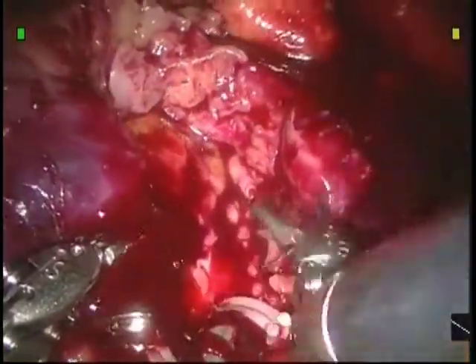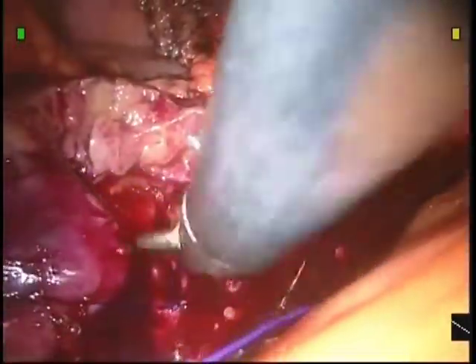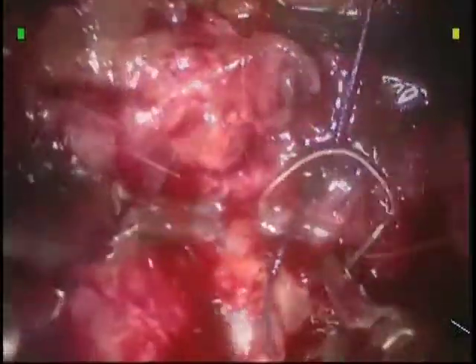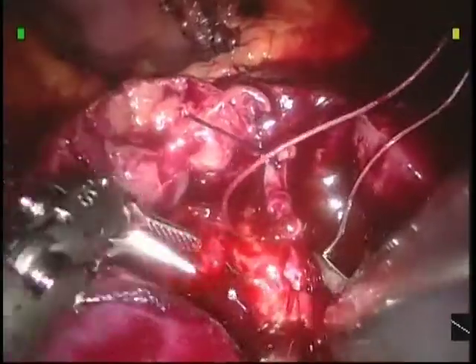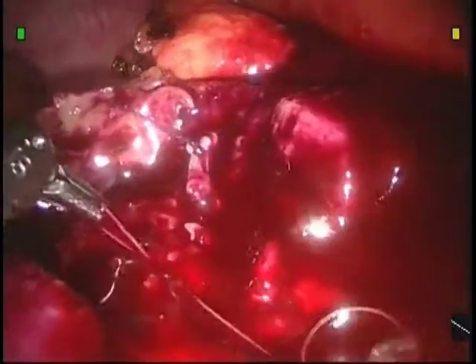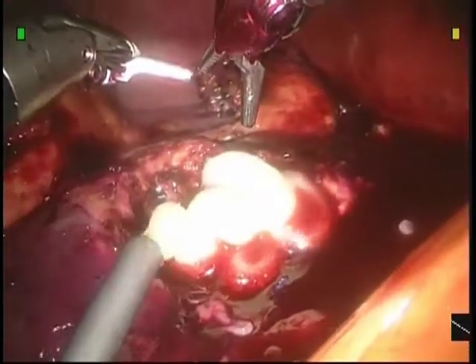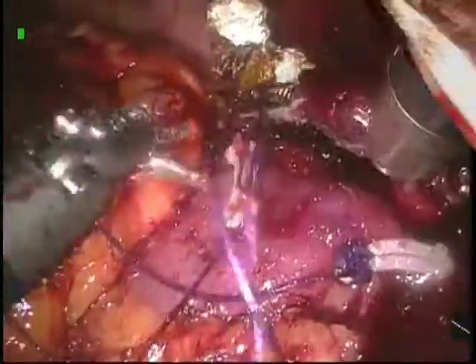Once the mass is completely excised, the vein is closed with a running 4-0 prolene suture. Next, the collecting system is closed with a running 4-0 vicryl suture. Cortical edges are cauterized, hemostatic matrix is applied, and a surgicel bolster is secured in place.